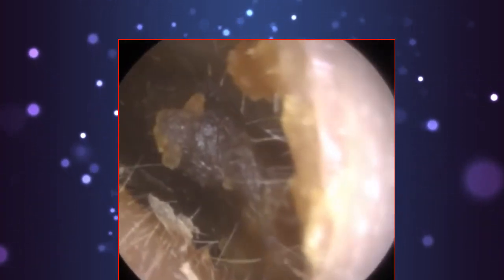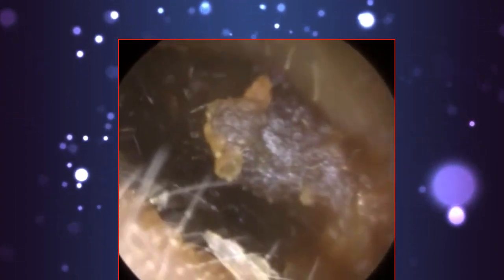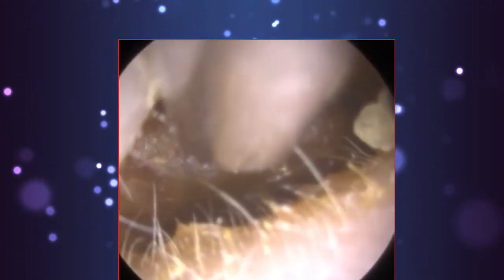And I did promise I'd try and get this video up as soon as I can. I also airdropped this procedure to the patient. They had an iPhone, and with the iClearScope, because we use an iPod as the viewing monitor and camera, we've got the capability of airdropping procedures to patients.